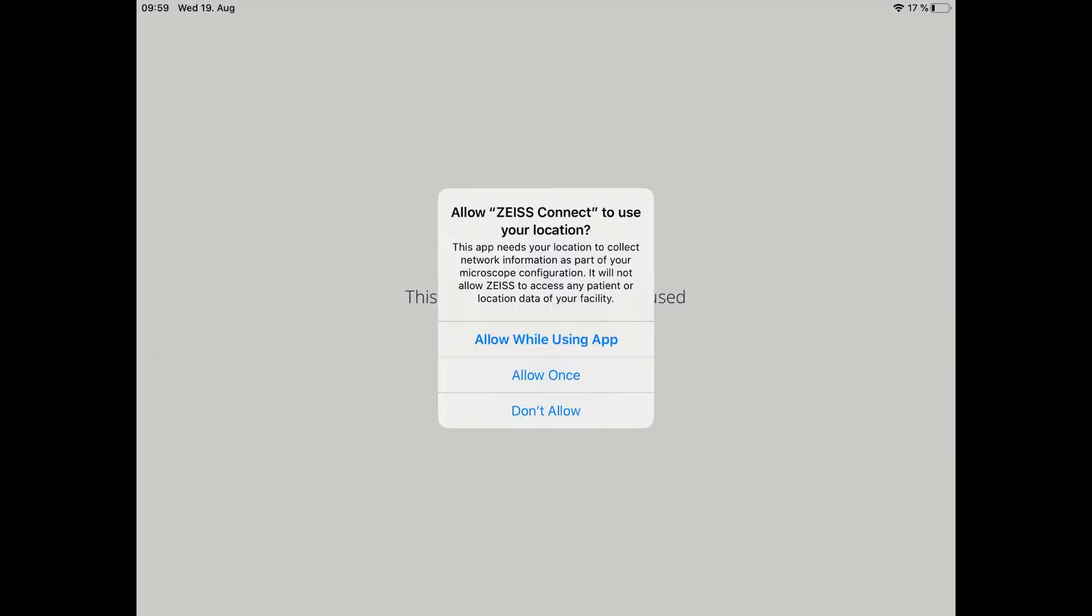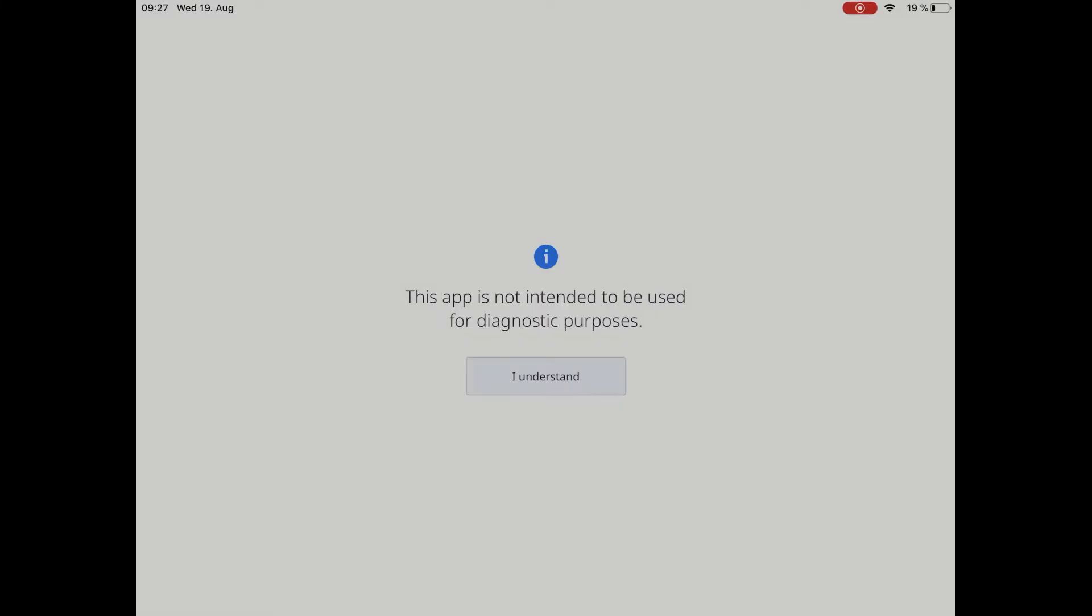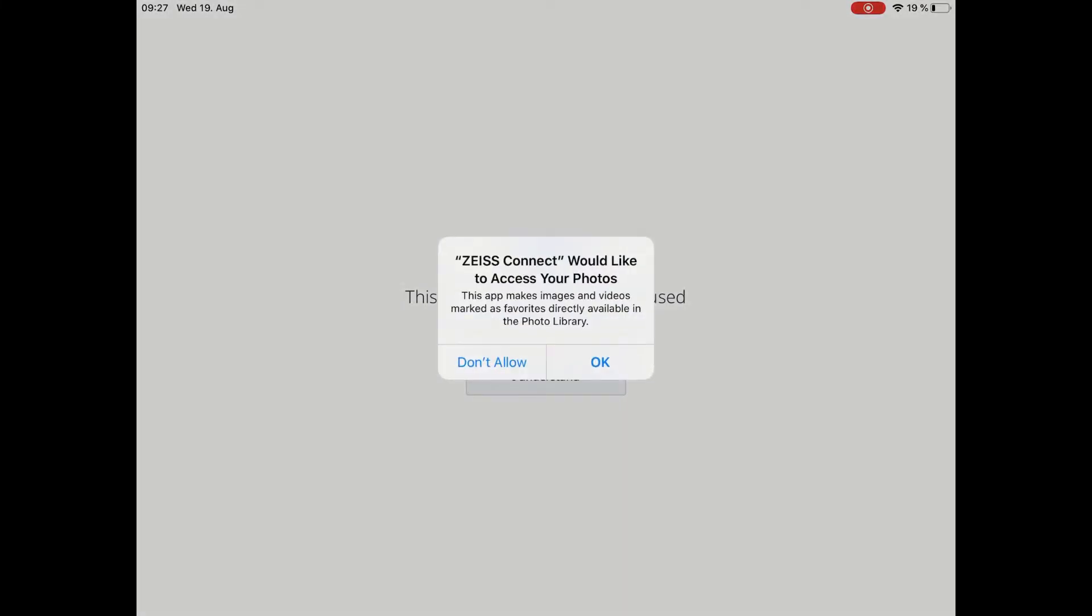You are asked to allow ZEISS Connect to use your location. Please choose here Allow While Using App. ZEISS will not receive any data from you. This setting is required to assign the network.